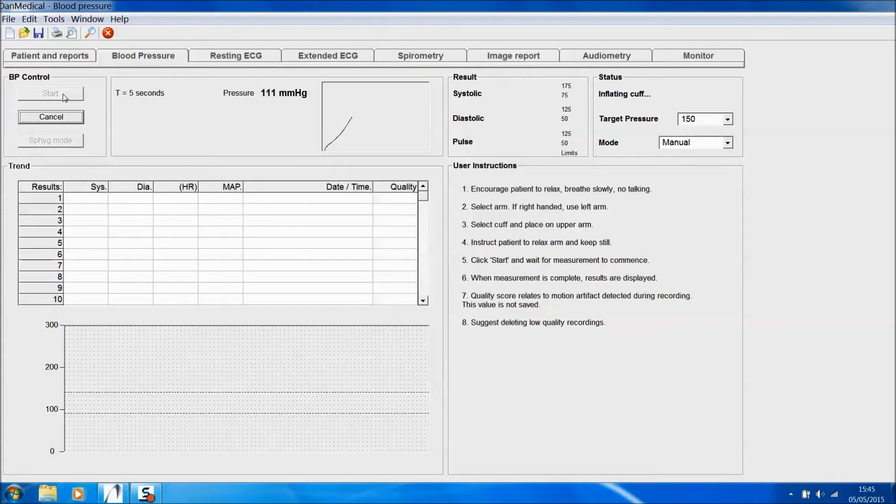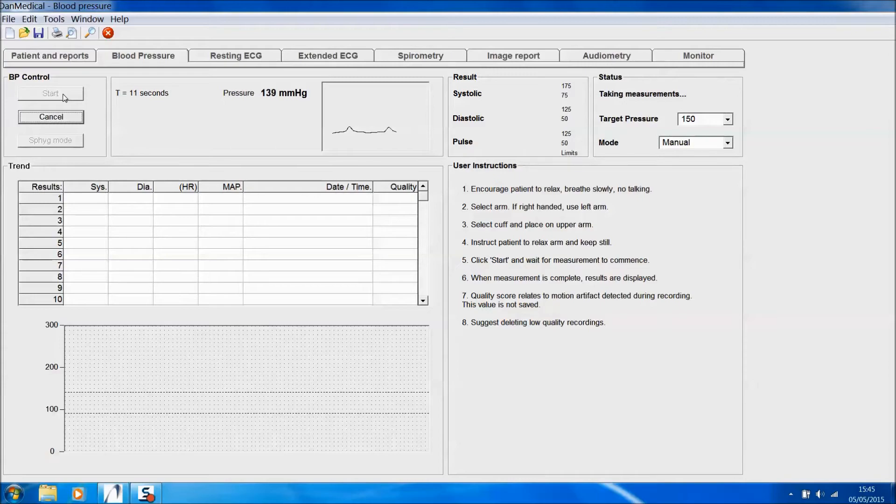The pressure in the cuff increases automatically up to the target pressure, and once the pressure reaches the target, measurements will begin.